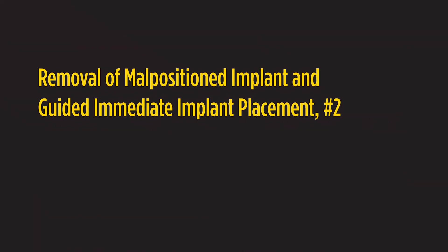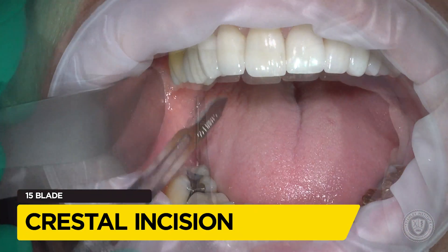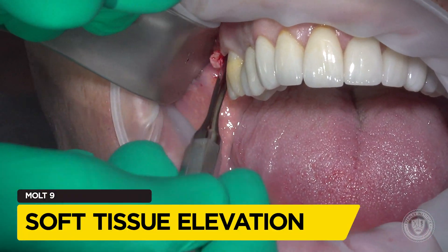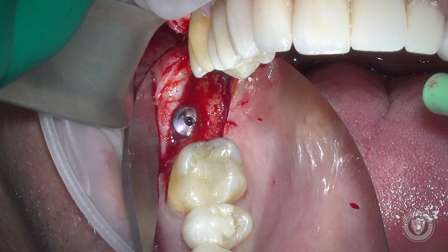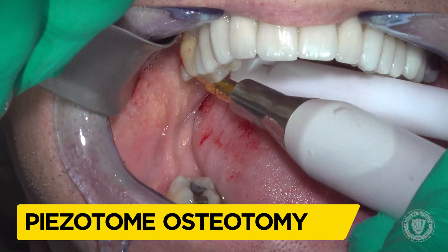Removal of a malpositioned implant and guided immediate implant placement in the number 2 location. This particular video is a little challenging to see, as it's in the number 2 position. The implant has been in for five years, was never restored, and was placed too buccal — as can be seen in this image — as well as too far distally to actually be restored in any effective manner.